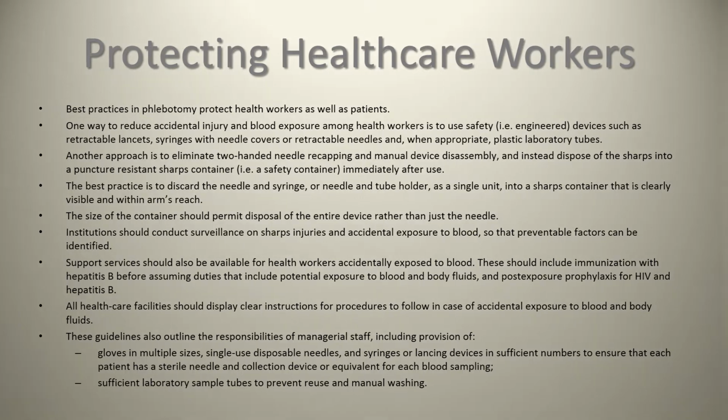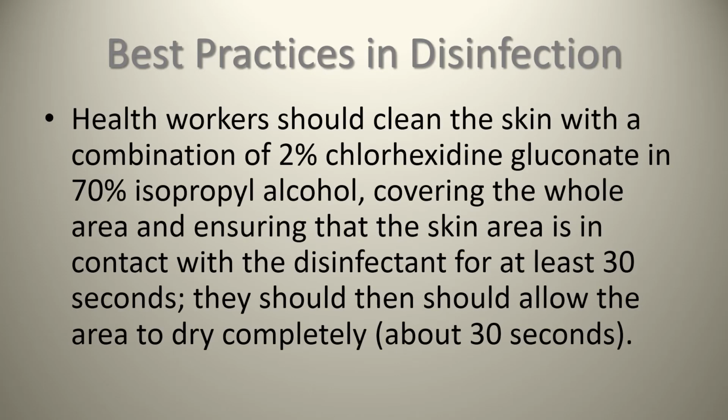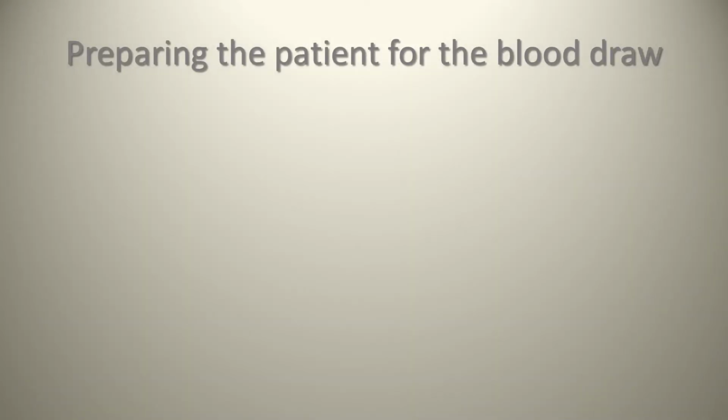So best practices in disinfection. The current guideline is health workers should cleanse the skin with a combination of 2% chlorhexidine gluconate in 70% isopropyl alcohol, covering the whole area and ensuring that the skin area is in contact with the disinfectant for at least 30 seconds, and then you should also allow a sufficient amount of time for the area to dry completely. Preparing the patient for the blood draw. So ask the patient if they have a latex allergy.